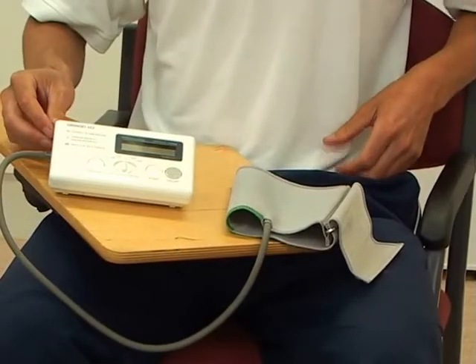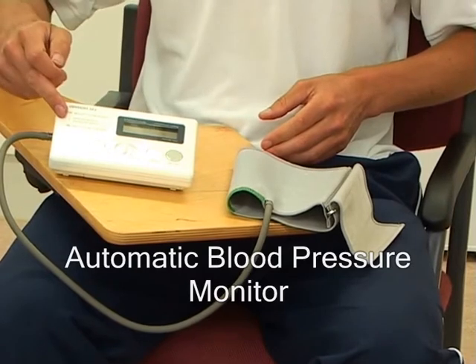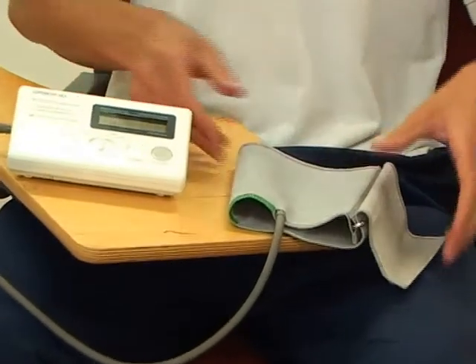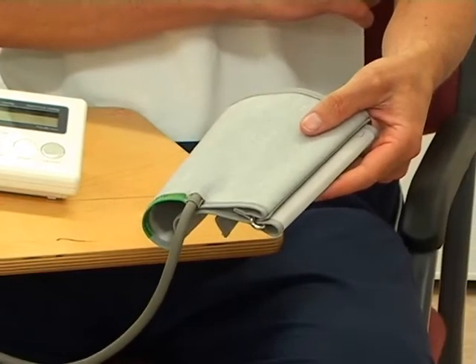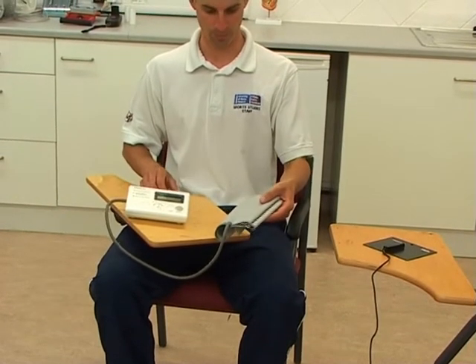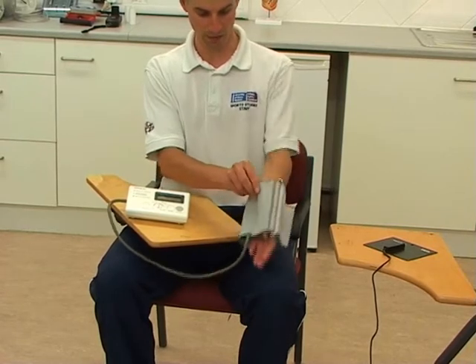We're now going to look at taking a reading of blood pressure using this device here, which is an automatic blood pressure monitor. It's a simple device that has a cuff that needs to be fitted on your left arm. It needs to be switched on and started, and the unit will then take all the readings itself. Firstly, position the cuff correctly on your left arm.